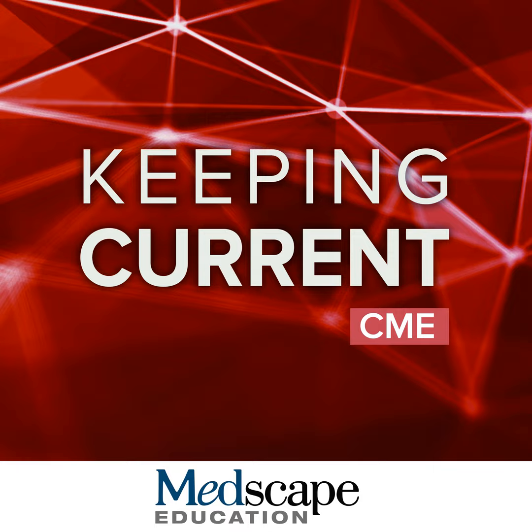If we look at hypovascular nodules, which are noted on CT, and then try to figure out which one of them or how many of them will end up developing arterial phase hyperenhancement, meaning they will turn into classic, quote unquote, HCCs, we can actually subgroup the patients based on hepatobiliary phase appearance.